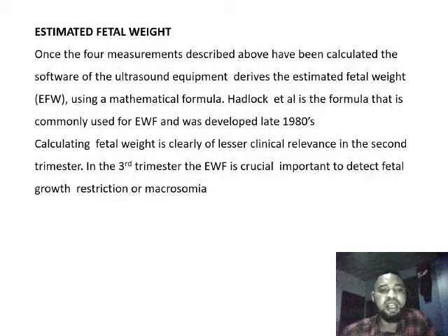This is the formula that is commonly used for fetal weight and was developed in the late 1980s. Calculating fetal weight is clearly of lesser clinical relevance in the second trimester. In the third trimester, the fetal weight is crucially important to detect fetal growth restriction or macrosomia.